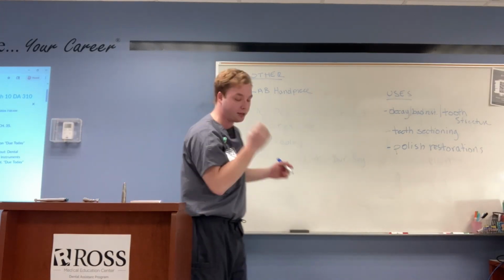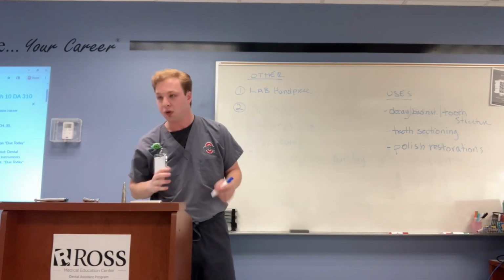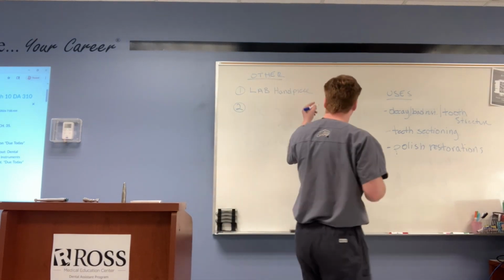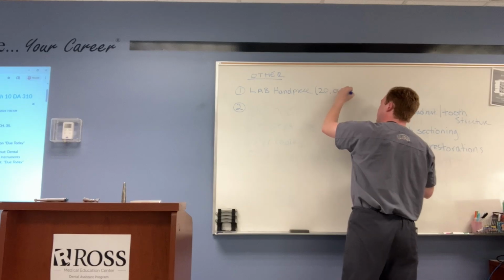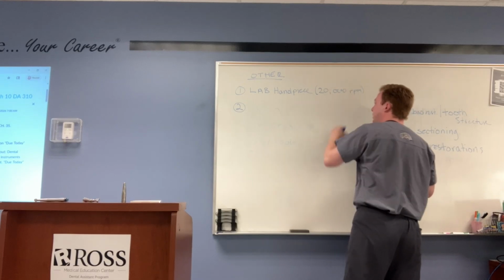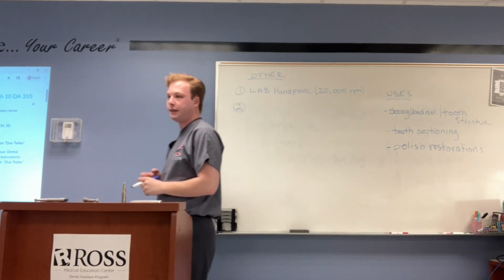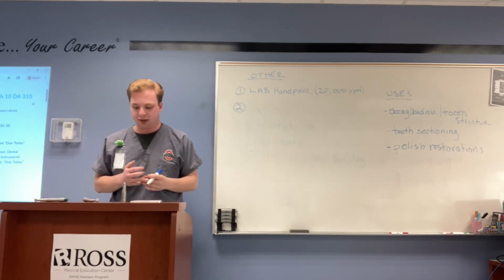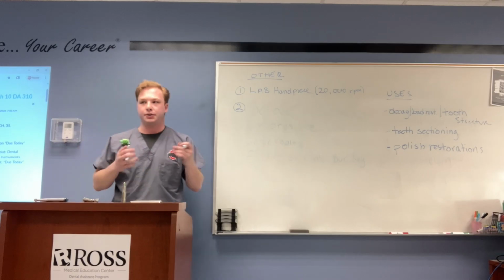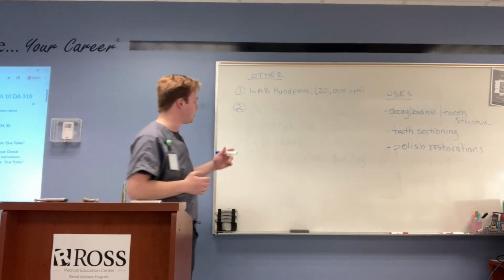And you can write down, it goes up to about 20,000 RPMs if you want, just for reference. Okay, that's the lab handpiece. And then again, if you're going on to hygiene and you're doing scaling and root planing, then you'll see the ultrasonic handpiece.